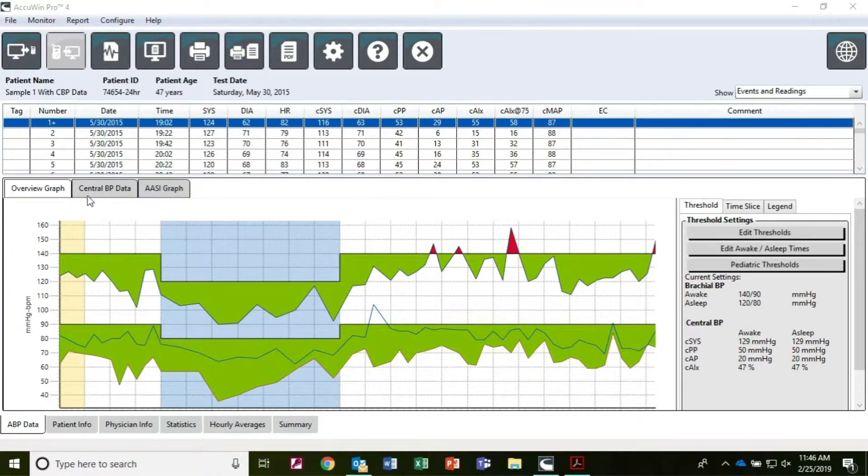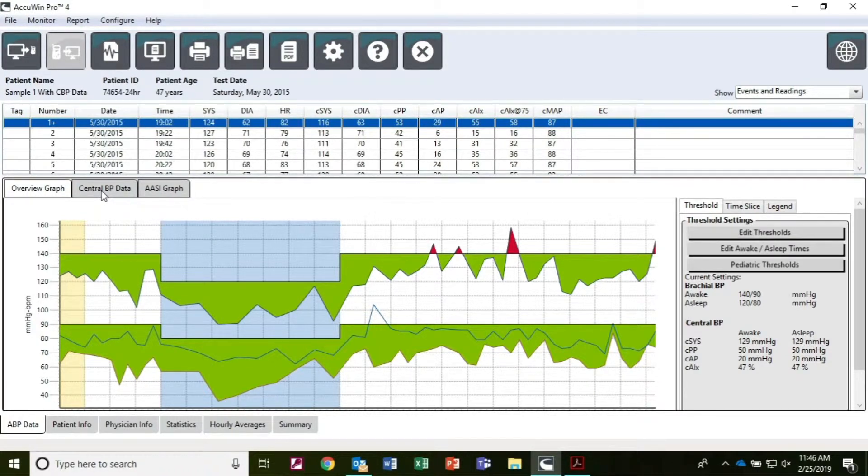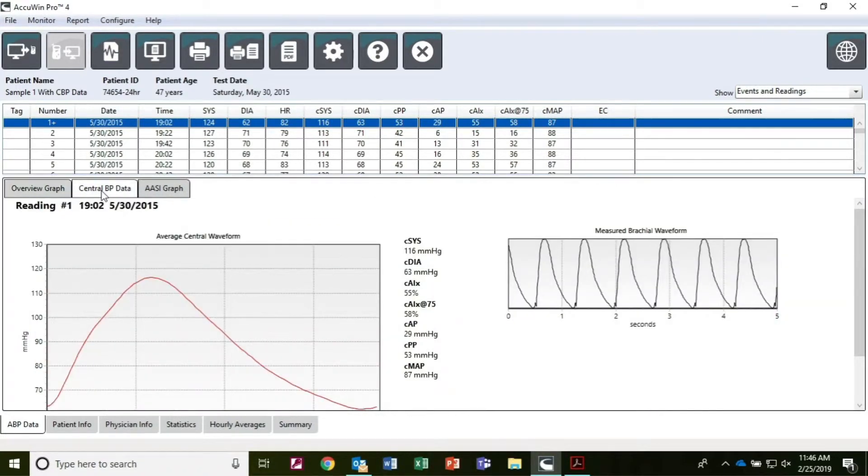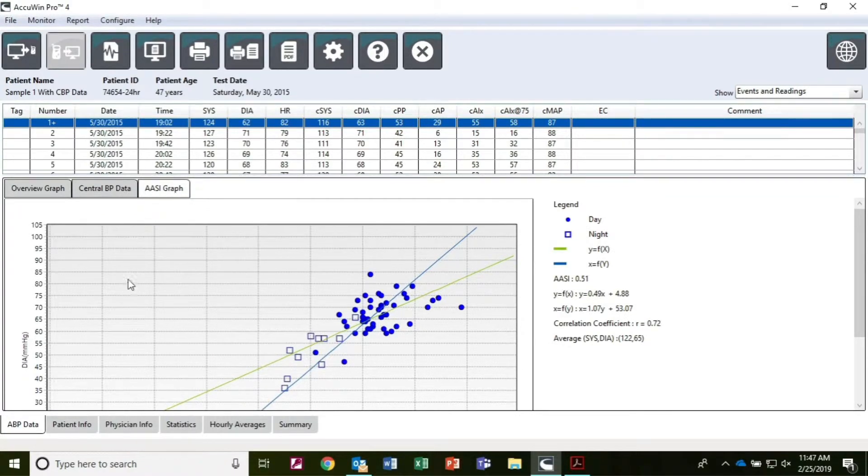The ABP data tab shows the individual readings and events during the study, as well as a graphical representation of the data. When used, central blood pressure waveforms and ambulatory arterial stiffness index information are available on this tab.